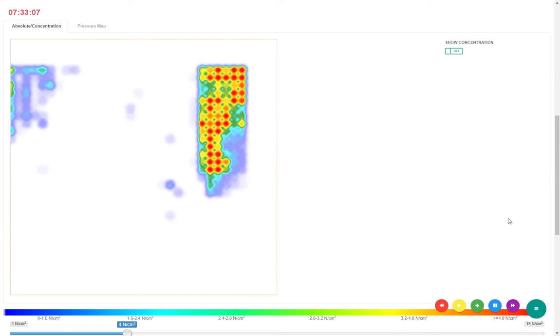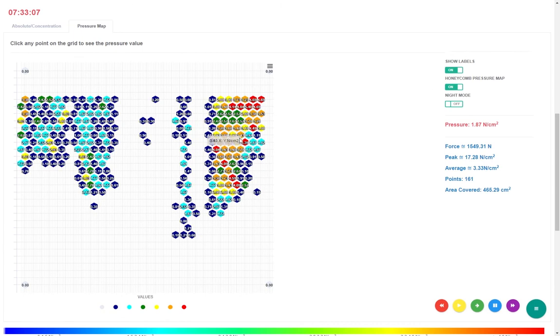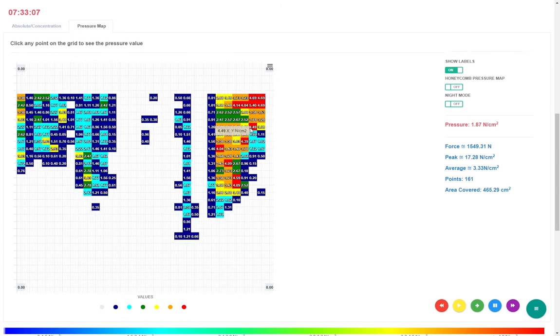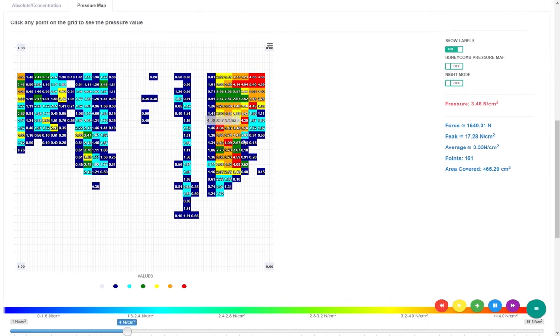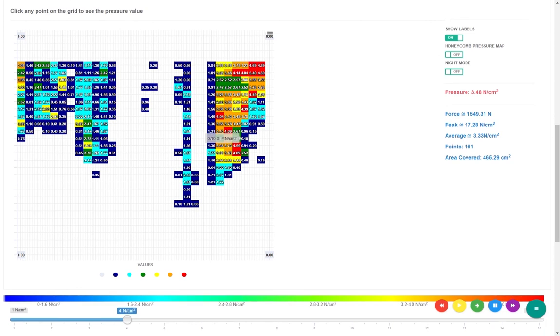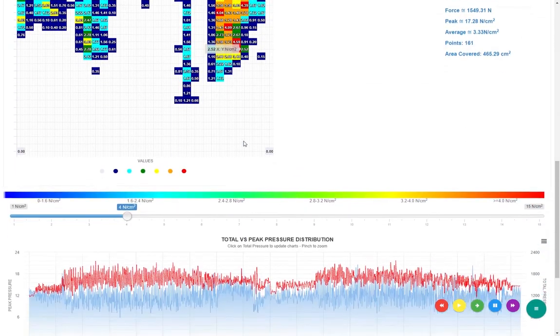It has multiple views that you can switch to. You can click on any point and identify approximate pressure exerted on any given point. All pressure points can be enabled to give you a wider picture.